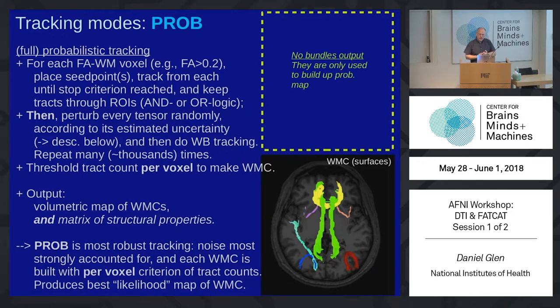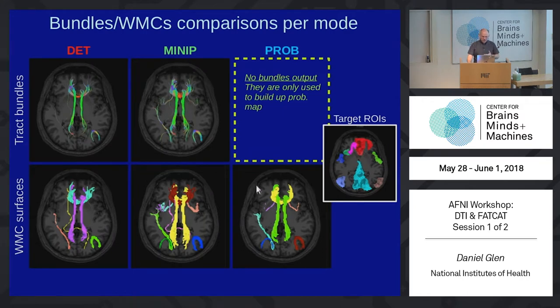Then you have full probabilistic tracking. We'll repeat this thousands and thousands of times in the same way as mini prob. But in this case we don't see those thousands of fibers — we just say, based on some threshold, is this voxel included in our connection? If it's still there, we'll keep it as part of that connection. That's generally what we recommend for your final analysis — to use the probabilistic tracking. You will have these kinds of surfaces, you get similar things as the deterministic and mini probabilistic, but this is probably the way to go.